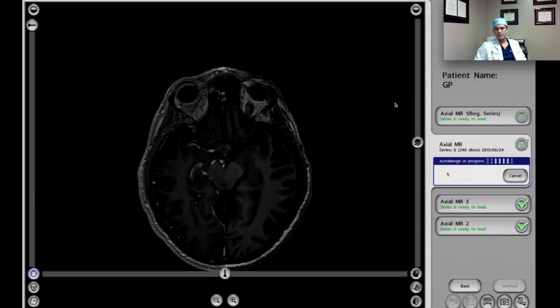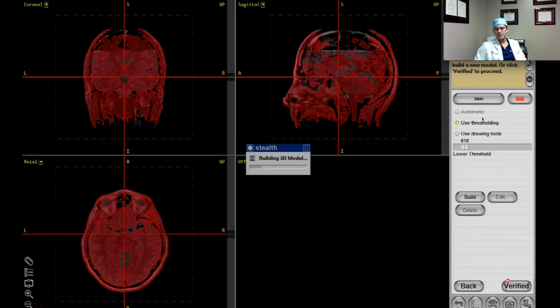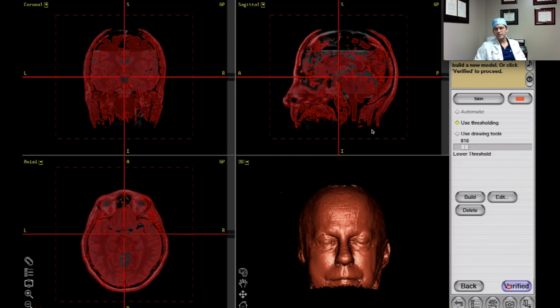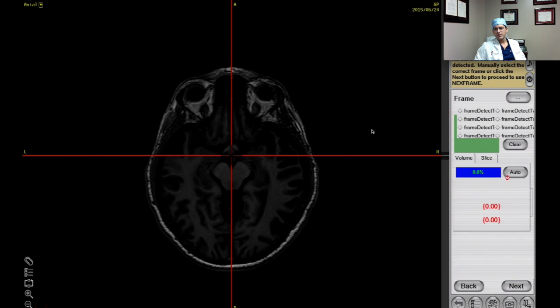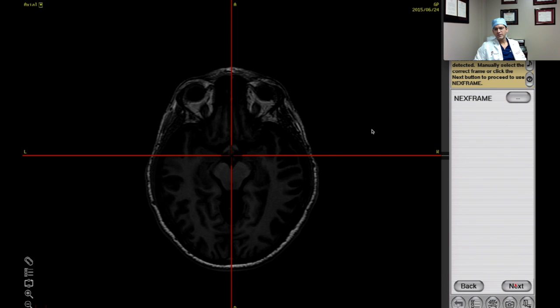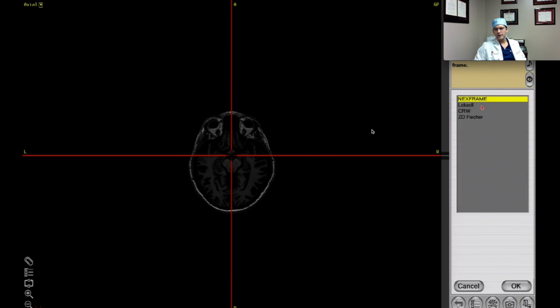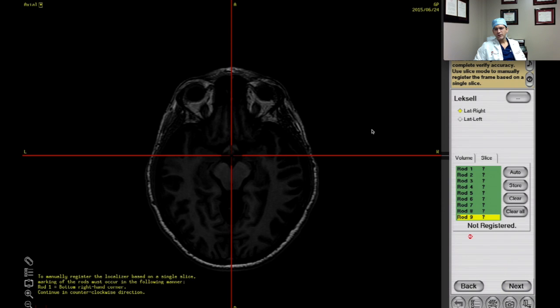What I'm doing here is fusing and merging the various studies. My registration scan is at the top, and that's the SPGR. I kind of verify all of these initially, and I double check that we actually have a good merge later on, once I've assigned the anterior commissure, posterior commissure, and basically reformatted the imaging.